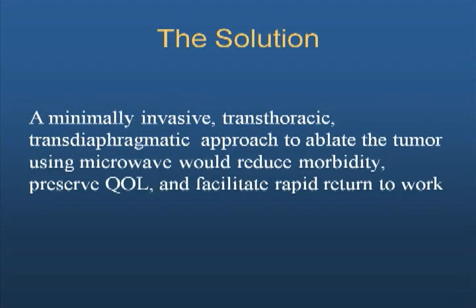A solution to this problem is the use of a minimally invasive transthoracic transdiaphragmatic approach to ablate the tumor using microwave. This would reduce the patient's morbidity, preserve his short-term quality of life, and facilitate a rapid return to work.